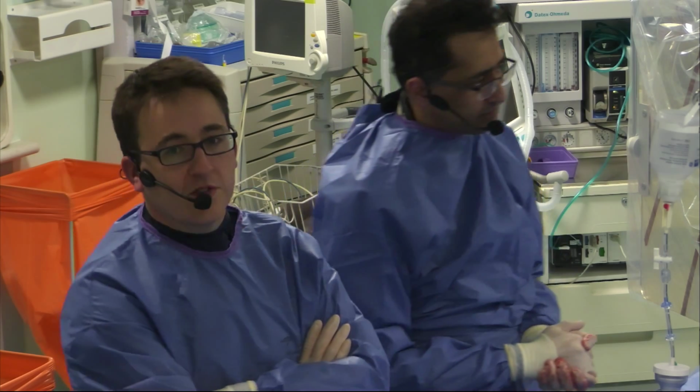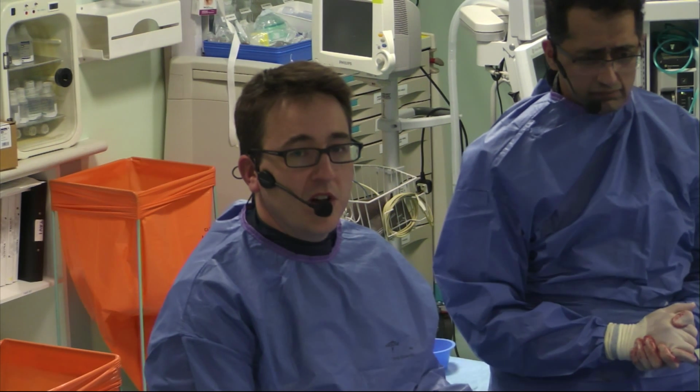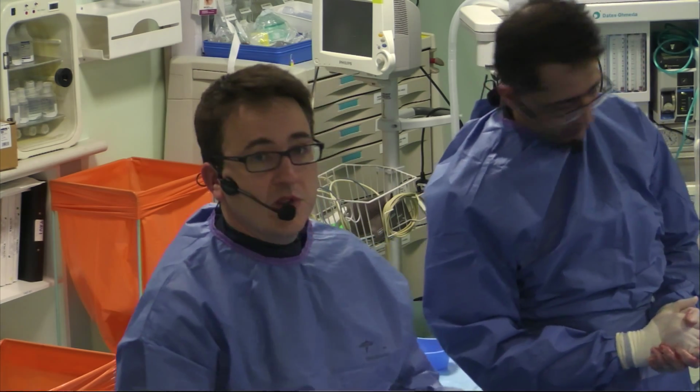Okay, great. Here we've seen the use of physiology backed up by the IVUS, and I think a key thing with the IVUS was that we confirmed, in an angiographically difficult takeoff, that there was no tight stenosis at its ostium. So I think we're coming towards the end here, and the feed may cut off at any second.